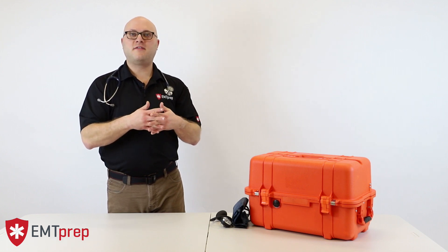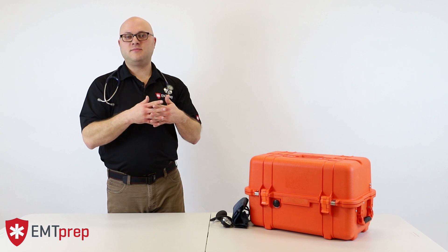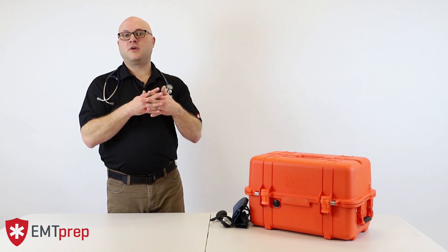I hope this clarifies how blood pressure is measured and the physical principles behind how we use the stethoscope to hear the sounds created by a blood pressure measurement.